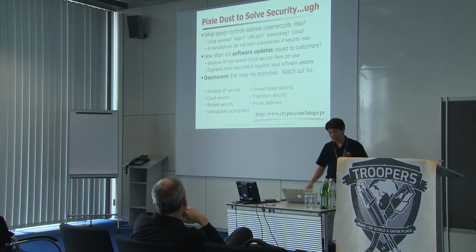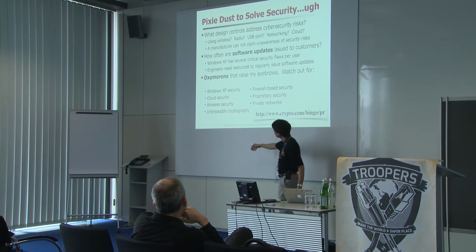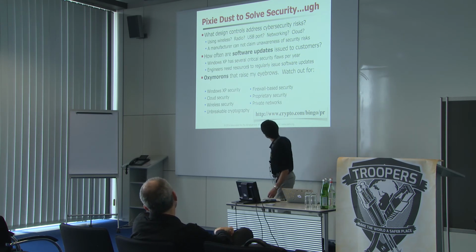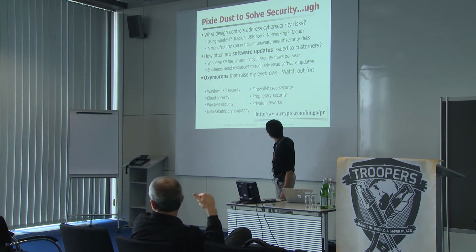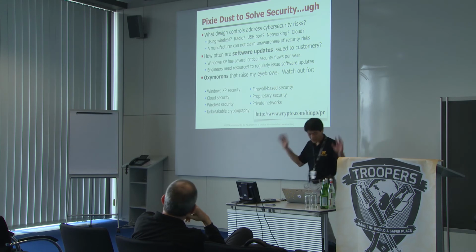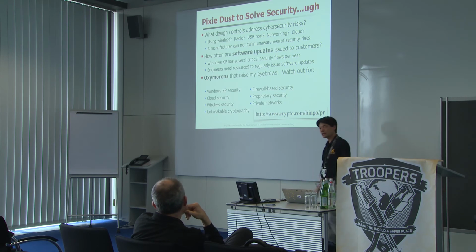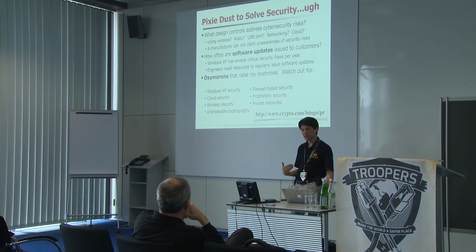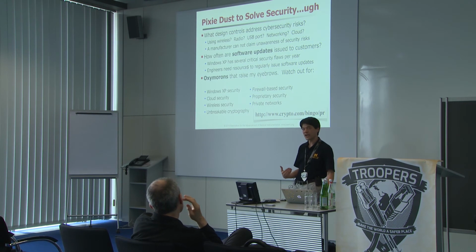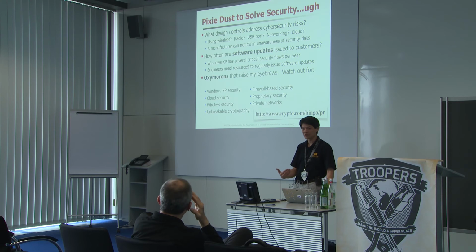And I'm sure you've all heard about what I call the pixie dust approach to security. You've probably heard these in your travels. These are my favorite oxymorons down here, as medical manufacturers are looking to buy silver bullets. Windows XP security is one of my favorites. Private networks. Yeah, just put the word private in front of it and then everything's okay. Proprietary security. I mean, we can laugh about that here, but there are many medical manufacturers who just don't yet understand that proprietary doesn't mean better in terms of security. And if you approach a manufacturer and laugh at them, they're not going to respond very well. So you need to figure out a way to deliver your message without calling them jerks.